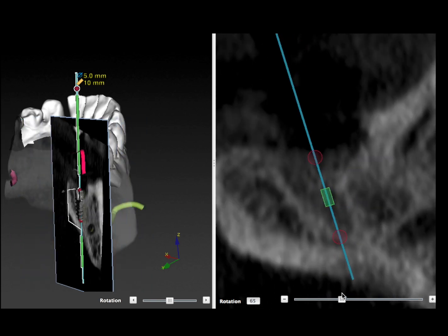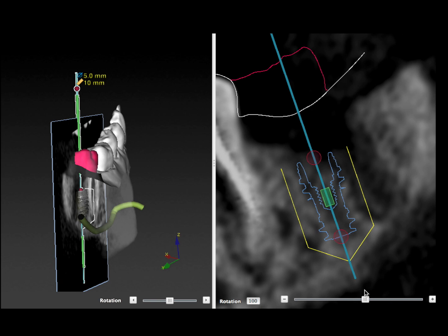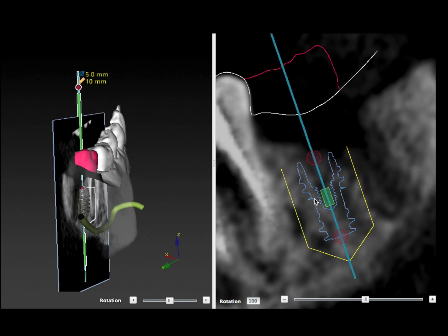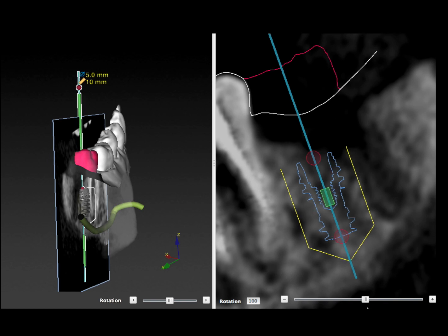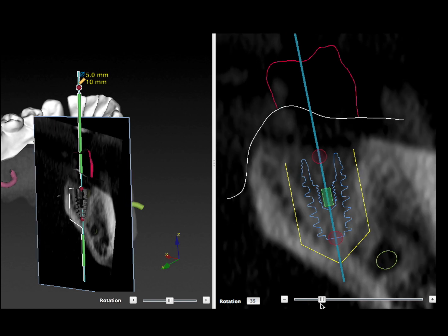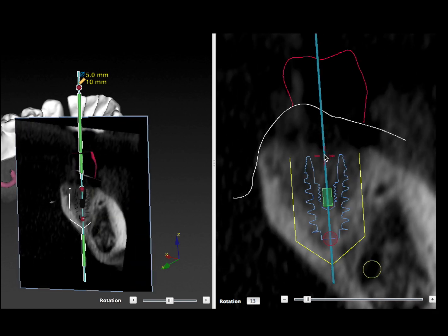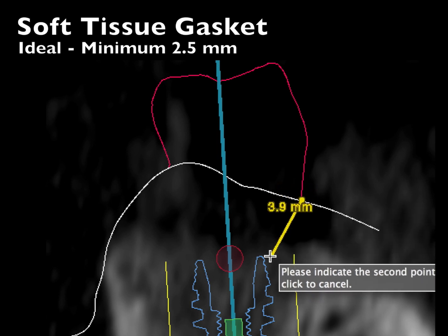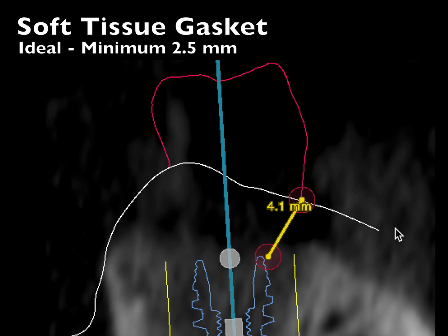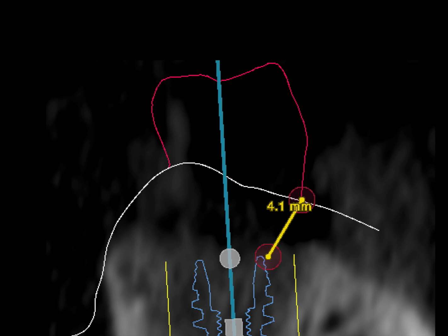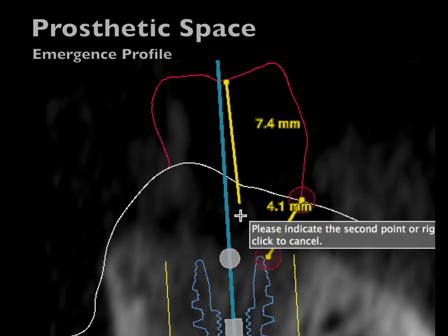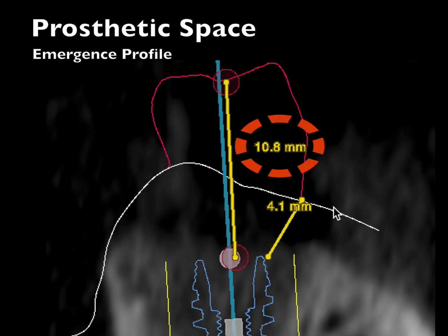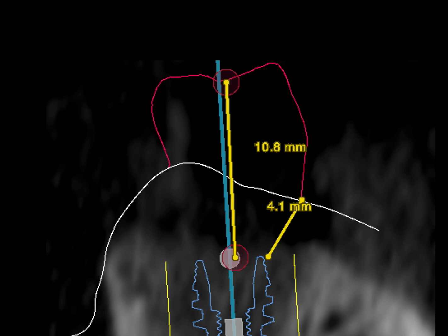We can also rotate around the implant to see how close we are to the adjacent root. Being too far would cause an emergence profile problem, so we want to snuggle this into the root to make sure we're in a good position relative to the final emergence of the crown. Since this is a molar we have to go a little more distal than 1.5 millimeters to the root because of tissue and crown emergence. For the soft tissue gasket we want at least 2.5 millimeters of soft tissue around the top of the implant to preserve bone, as shown by the literature. Looking at prosthetic space, we have 10.8 millimeters, which is ideal and ensures enough space to make this crown nice and strong.